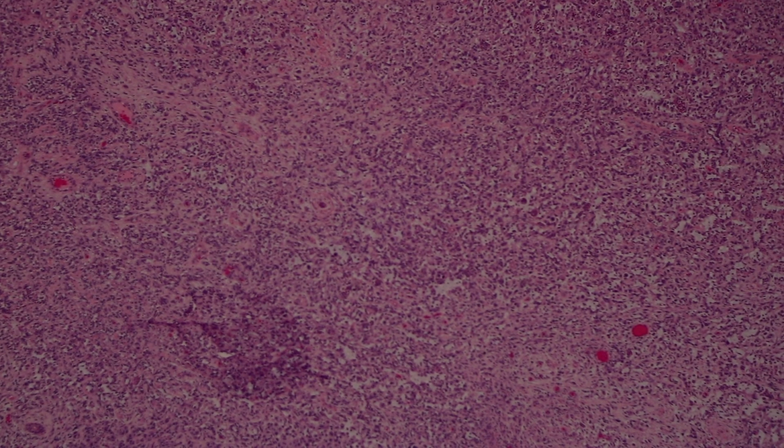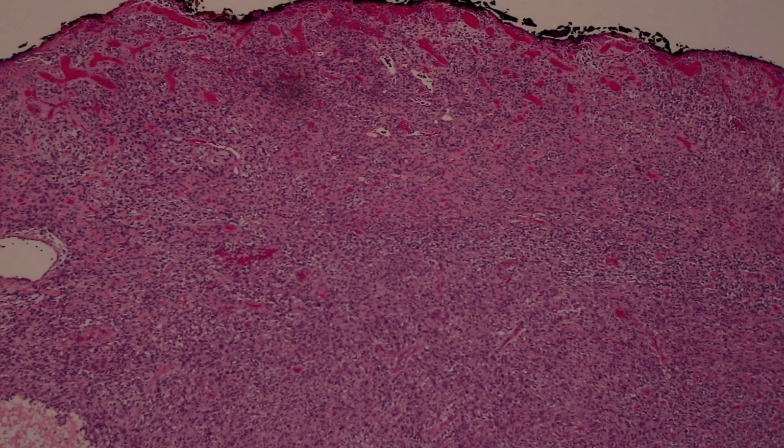When I see a squame that's poorly differentiated, really ugly, or really deep, if it goes into the subcutis or deeper, I tend to usually add a little template of additional features. I say the tumor thickness is however many millimeters from the surface down to the deepest invasion. And I say if I know that the tumor invades into the subcutis. And the reason I do that is that there is evidence that deeper squames and squames that go into the subcutis tend to behave more aggressively.